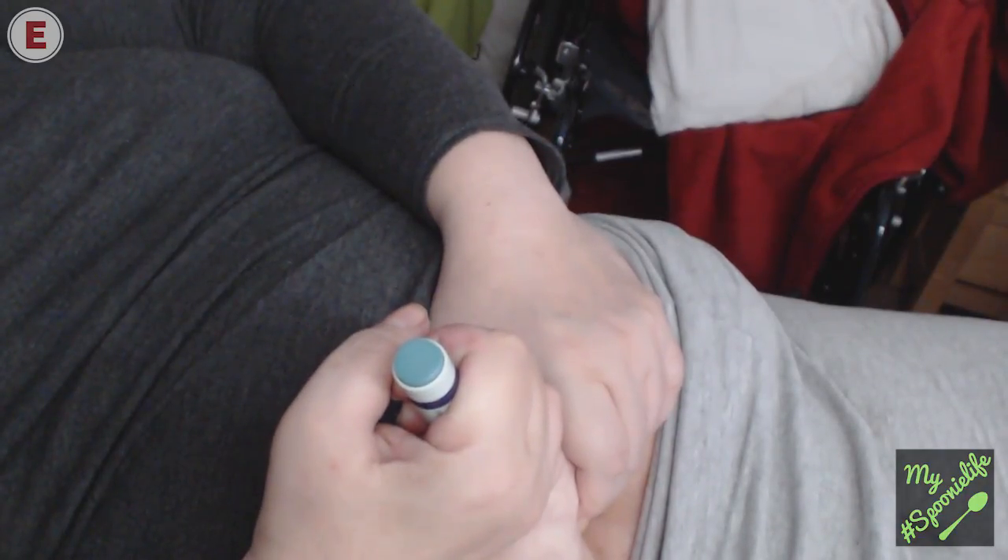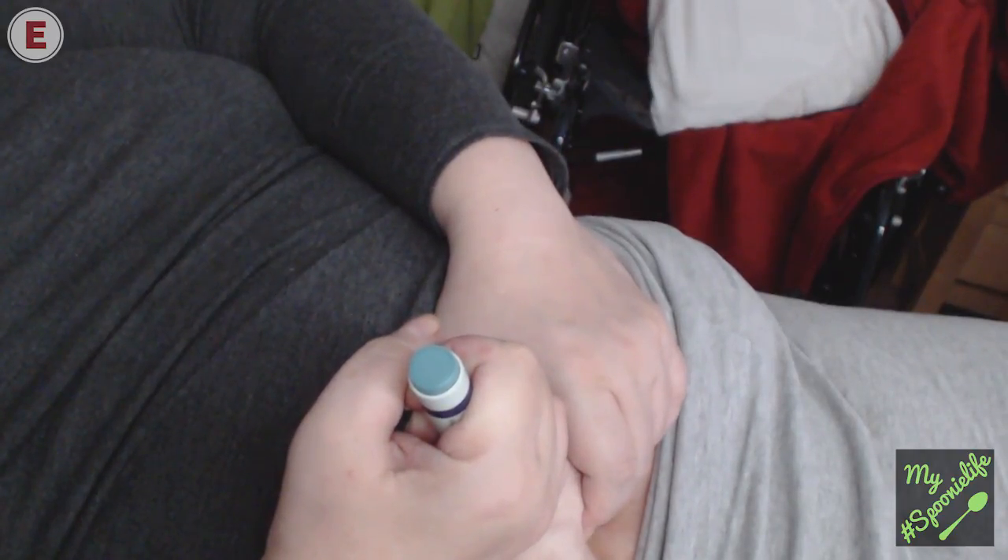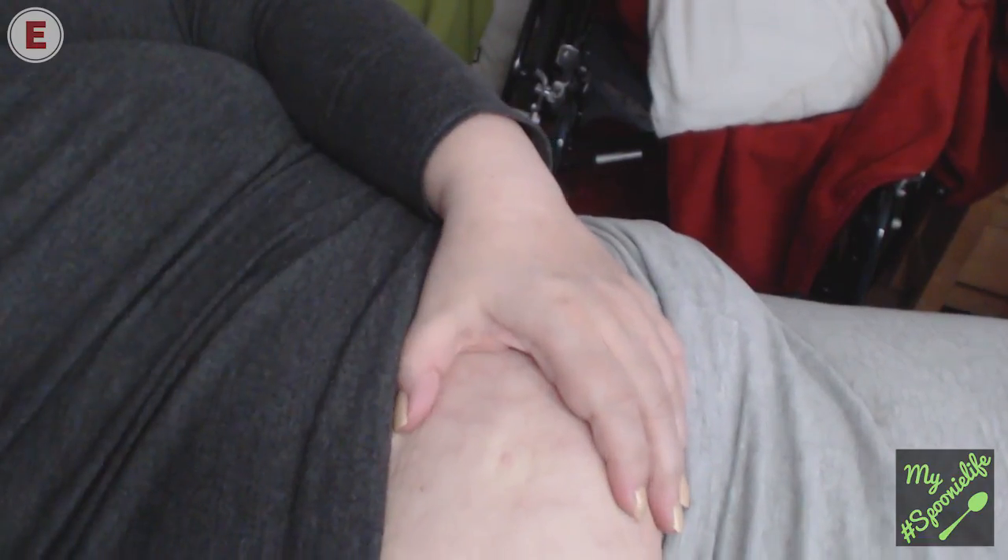And I push the button and I count to 10: 1, 2, 3, 4, 5, 6, 7, 8, 9, 10.